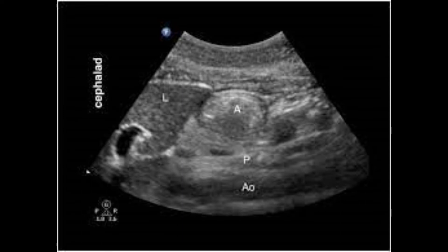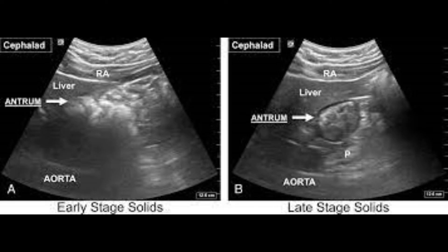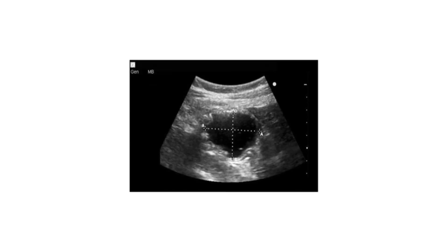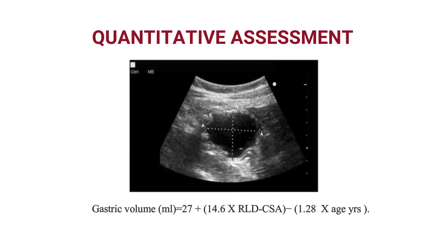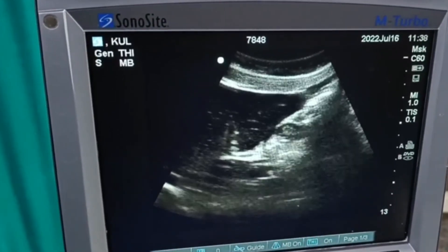Ingestion of solids initially gives a 'frosted glass' appearance, and after some time the solids appear hyperechoic with a heterogeneous consistency within a distended antrum. Current gastric volume measurement is developed only for assessment of clear fluid in the stomach, not for solid content. One can use the calipers of ultrasound equipment to measure the cross-sectional area, and use the given formula for that. The upper limit for this is 1.5 ml per kg.